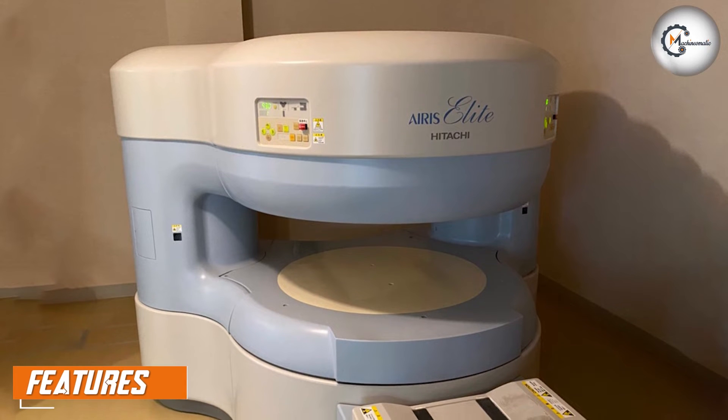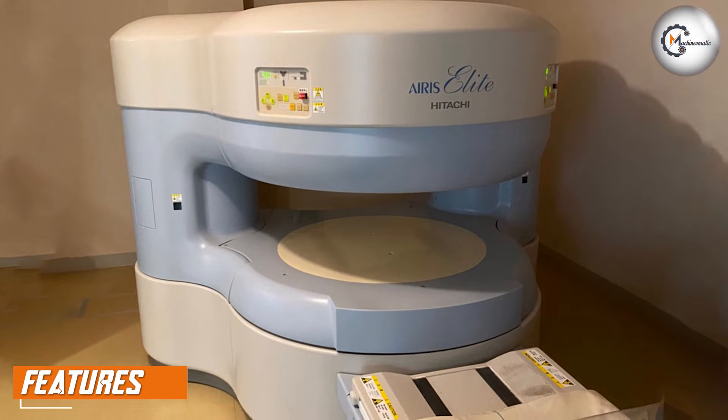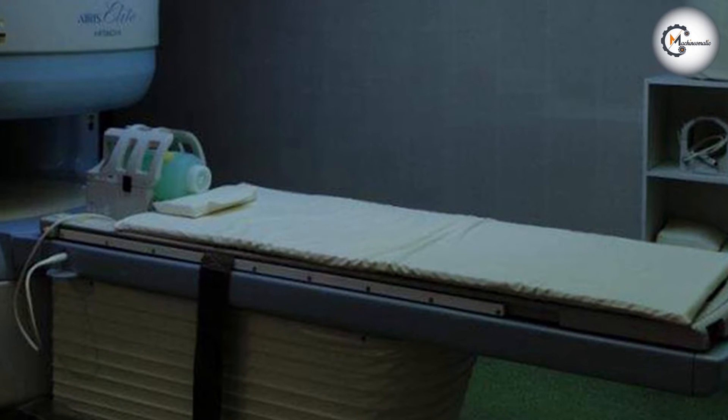One of the key features of the MRI machine is its compact design. The system has a small footprint, making it easy to install in a variety of locations. It's also lightweight, which makes it easy to move if needed.